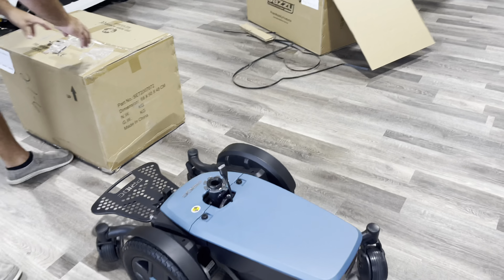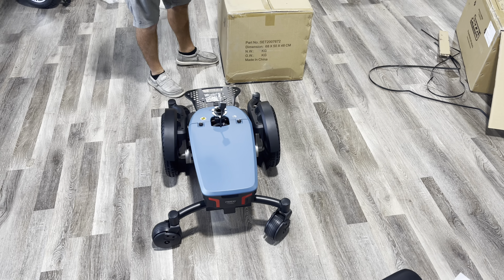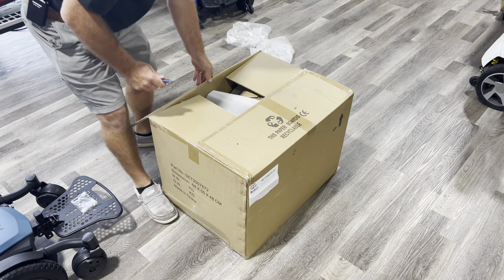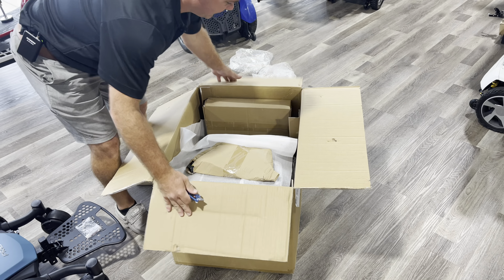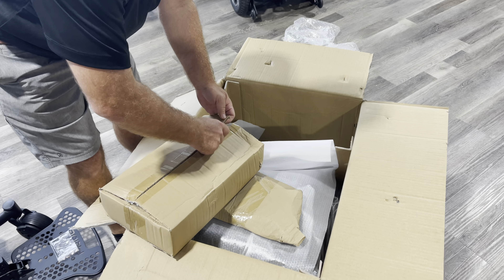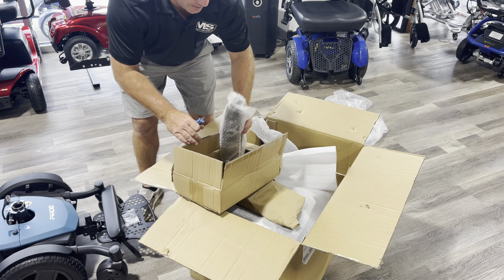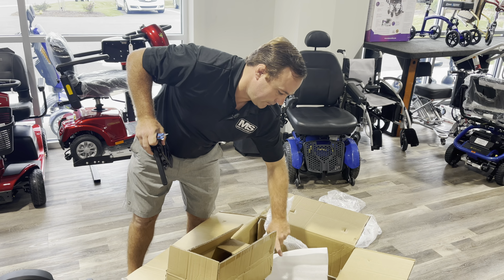Now we're going to go ahead and put the seat on. Just be careful cutting this - you don't want to cut the seat. They've improved this seat - I think they have a different type of fabric on it, and I know they have a waterproof seam line. Some people ask what does that mean? Well, if someone accidentally urinates in the chair, it doesn't break up the seams and start splitting the seats apart. If you currently have a power chair and that happens, you probably know what I mean - water doesn't get into the foam if you get water on it.